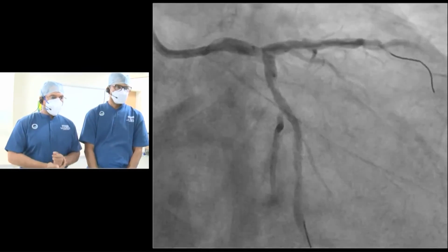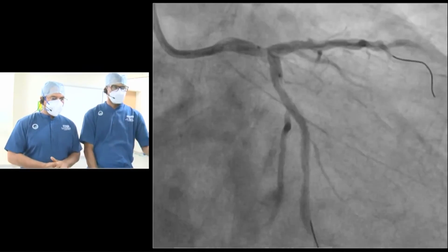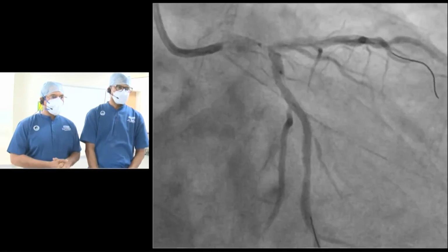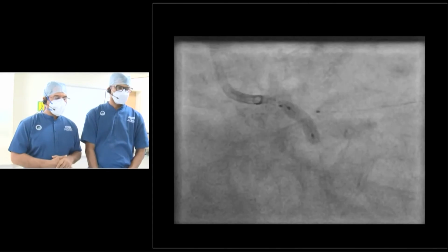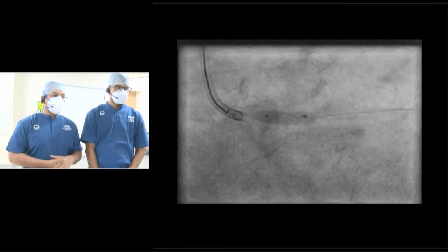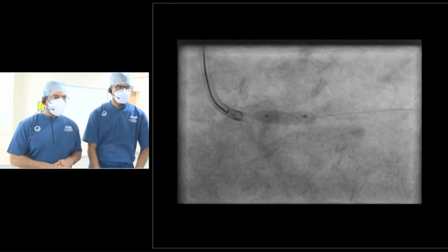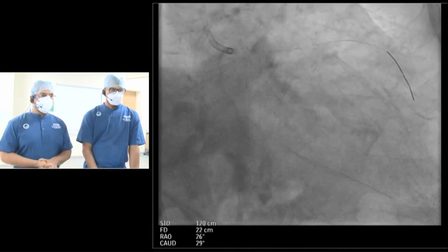First we placed the stent into the circumflex into the left main, that's a 3.5 into 12 Xience Expedition stent. We deployed it at 10 atmosphere. We placed a balloon before that in the left main to LAD, and we crushed the circumflex stent with a 3.5 into 12 millimeter NC balloon. We went up to 18 to 20 atmosphere. So that was the crush.